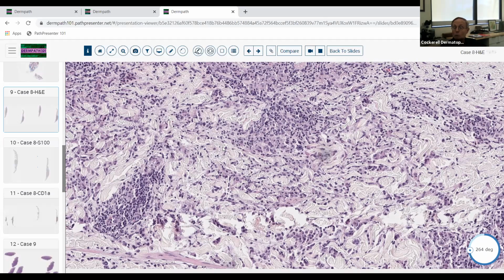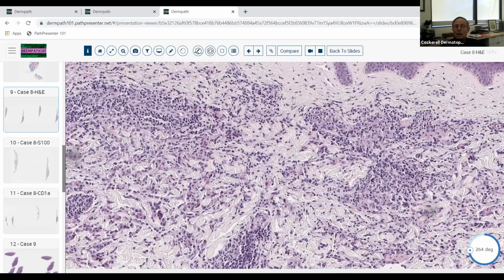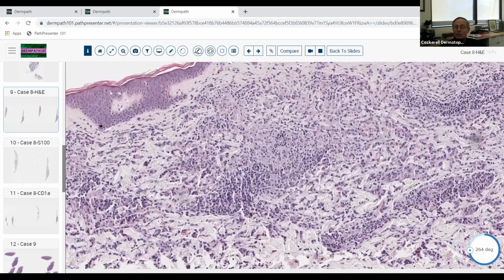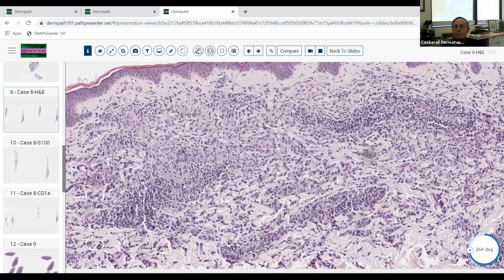The other thing that can do this is granuloma annulare. Those can look pretty similar, especially the interstitial form of GA, and the extracellular lipid of a really rapidly eruptive xanthoma, one that happens really, really quickly, can look a lot like mucin. We don't have a lot of that change here, but that's the classic differential diagnosis between eruptive xanthoma and granuloma annulare. So this was a patient that had an eruptive xanthoma with this inflammatory infiltrate. And again, in some of these you'll see this extracellular lipid.